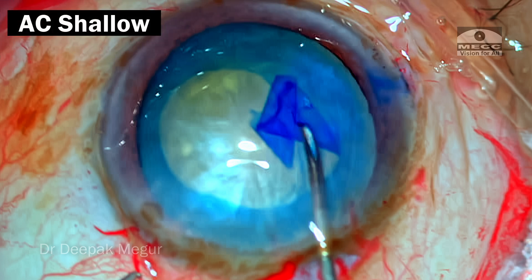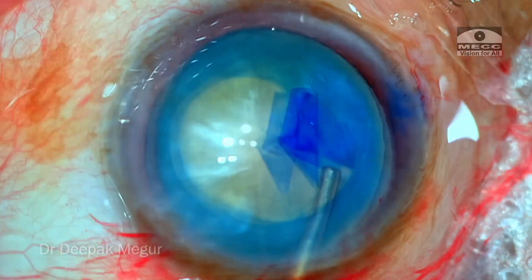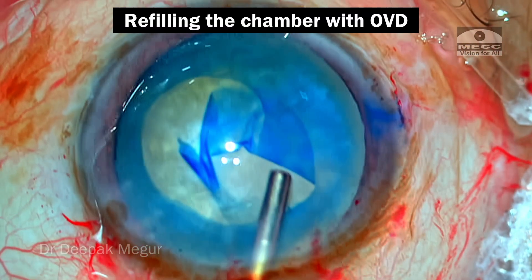The AC is shallowing, as is evident by the corneal folds. The trainee surgeon just comes out, realizes this, and pushes in more OVD — rightfully so.